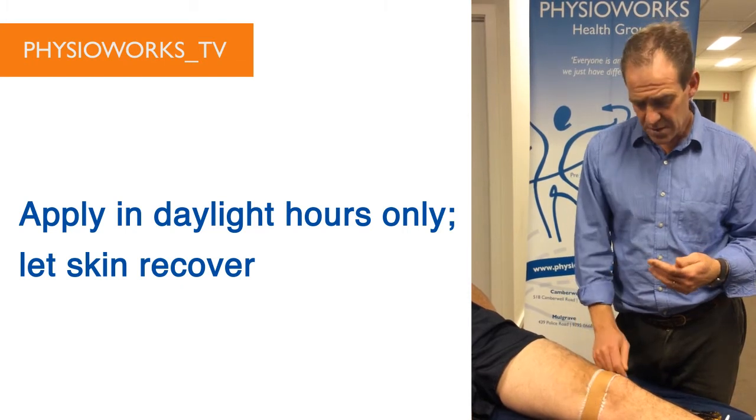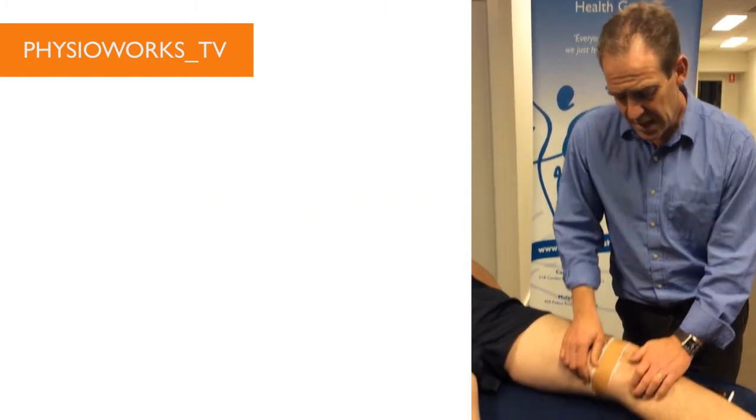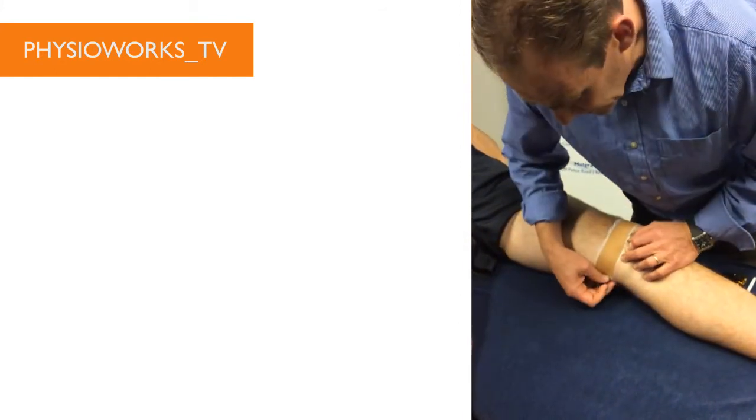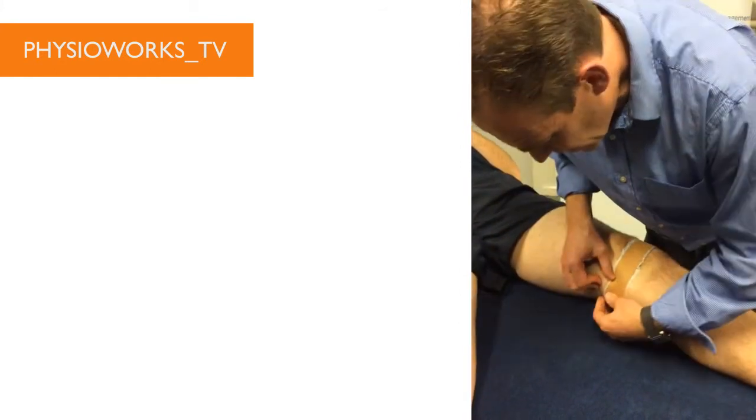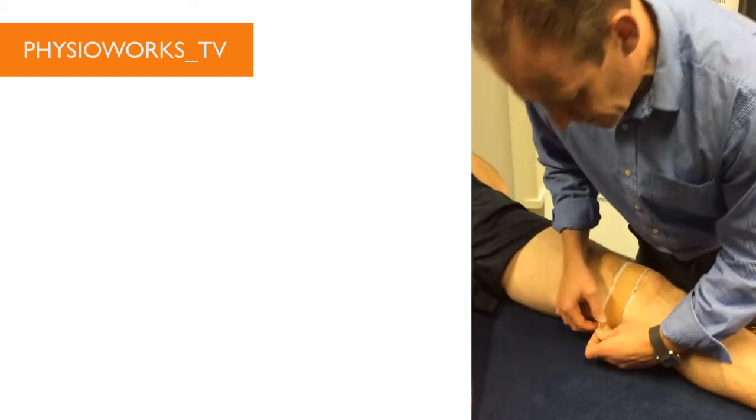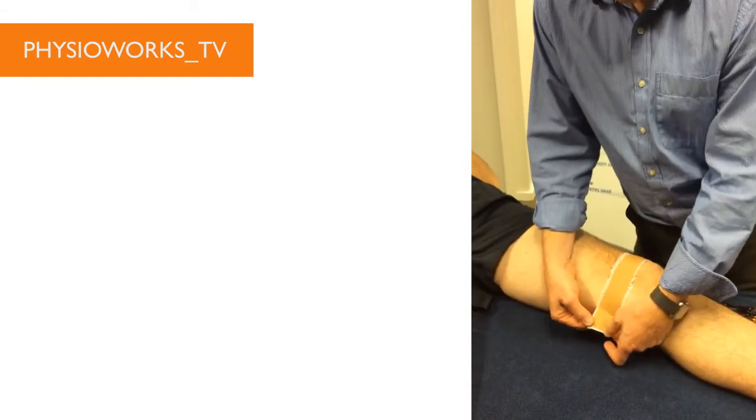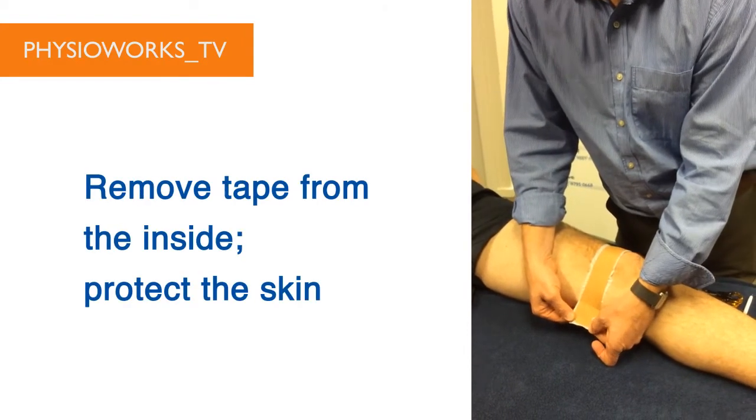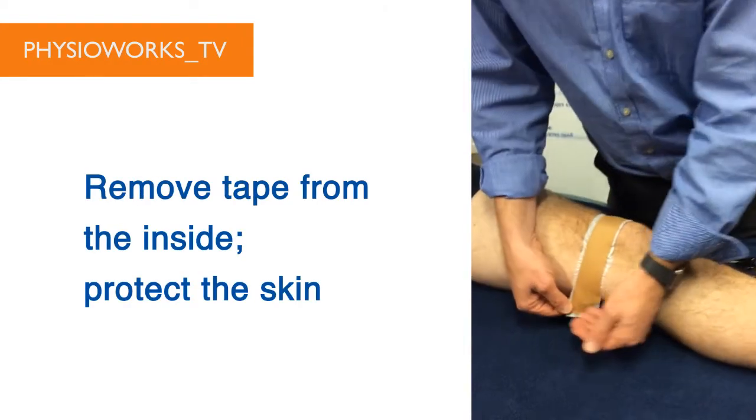When we take the tape off, you don't tear it quickly. We always start on the inside, which is where the skin can be quite fragile. Just grab a corner. As you'll notice here, the brown tape doesn't make contact with the skin. The white tape makes contact with the skin and the brown sits on the white.